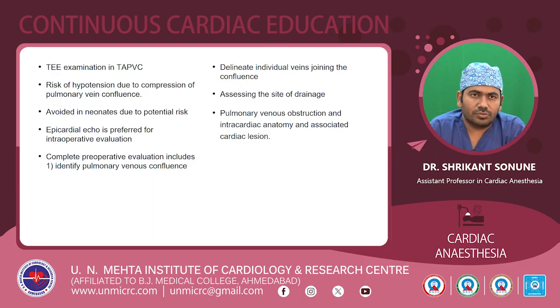The complete preoperative evaluation of TAPVC includes identifying the pulmonary venous confluence, delineating the individual veins which are joining the confluence, and assessing the site of drainage and whether there is any venous obstruction or any associated intracardiac lesion.